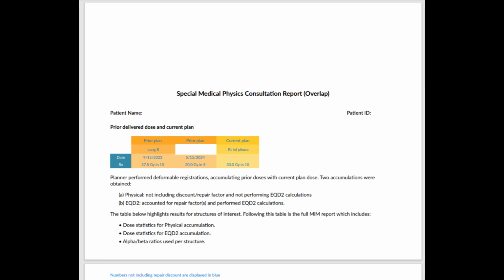It's typical to have 3 or more prior treatments and a couple or more current treatments. So you could easily be juggling 5 or 6 or more treatments, and each treatment has a CT, a dose, countless RT structures, etc. And each of these objects are almost never not duplicated in MIM, which keeps copies of things as the planner does their thing. Labeling is also a challenge, as you often have the same labels for things if you're retreating the same region. You have to keep a close eye on timestamps, etc.